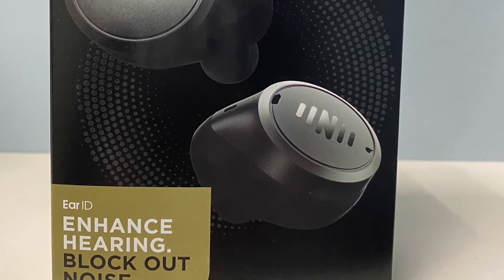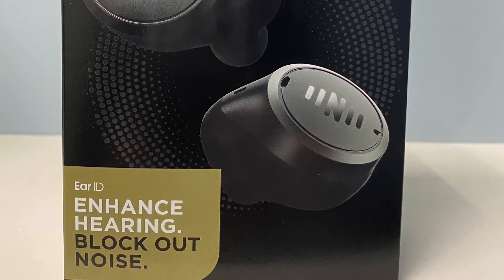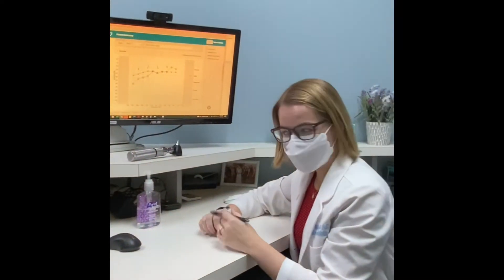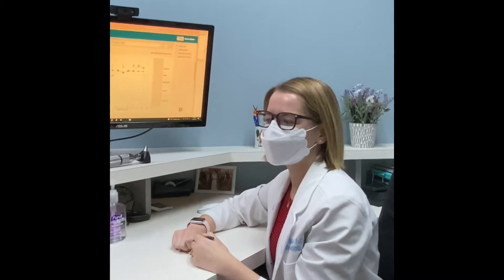Follow along as we review the effectiveness of self-fitting over-the-counter hearing aids. I'm Dr. Egan, and today we're going to do a little bit of an experience with some over-the-counter sound amplifiers.